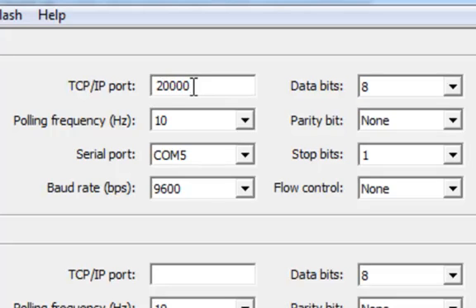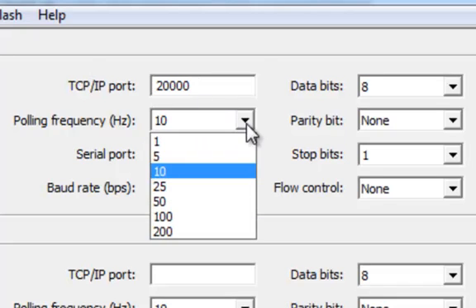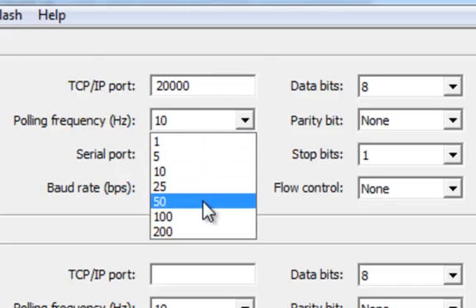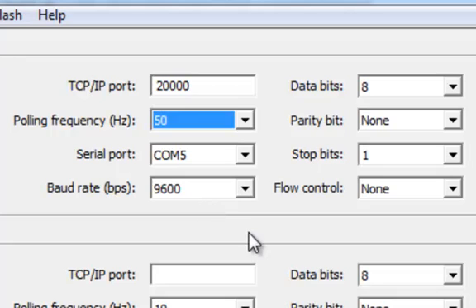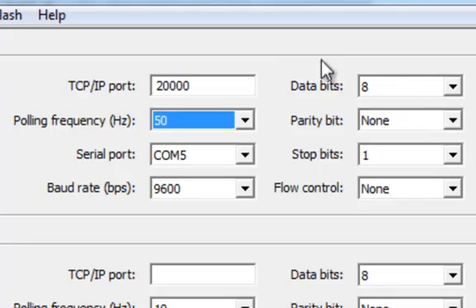Finally, I'm going to increase the polling frequency from 10 Hz to 50 Hz to match the sampling rate of the Shimmer's firmware. The rest of the settings can be left as they are. I can then listen for incoming connections by pressing Start.